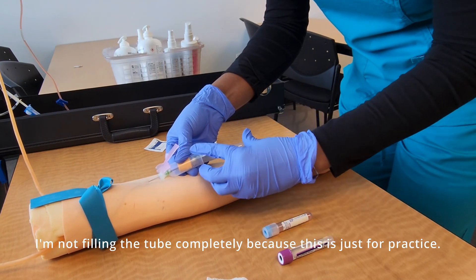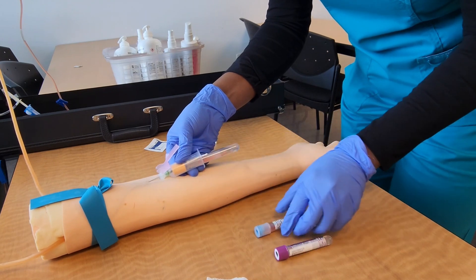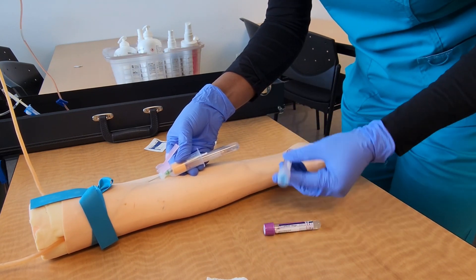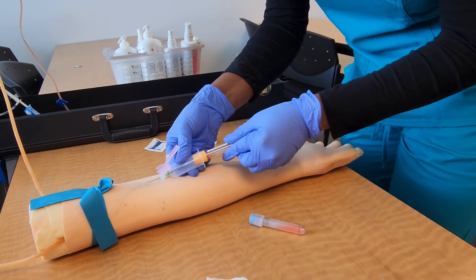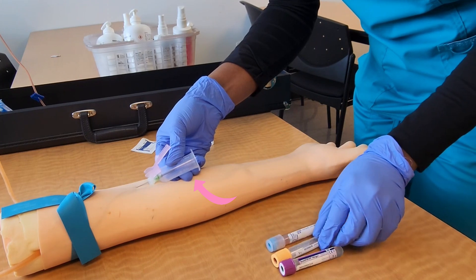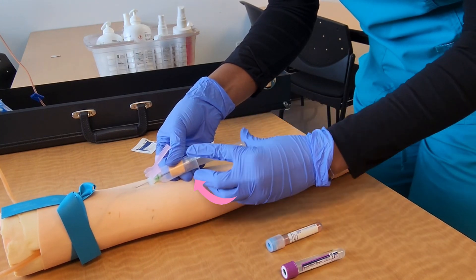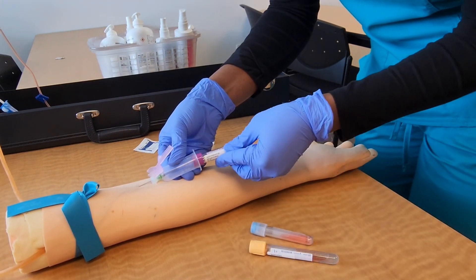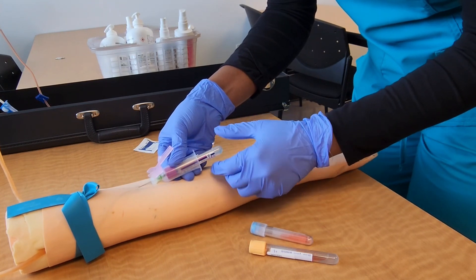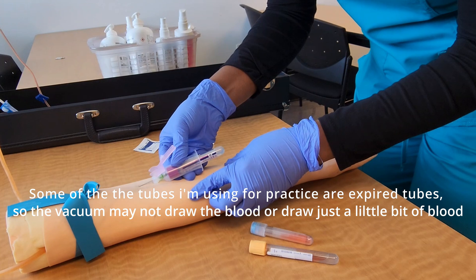Here I'm taking out the tube and inserting the next one. While it's filling, I'll go ahead and invert the previous tube. I'm also stabilizing my needle by applying gentle but firm pressure to the patient's arm with the back of my fingers. This helps during tube exchange to prevent movement of the needle in the vein.